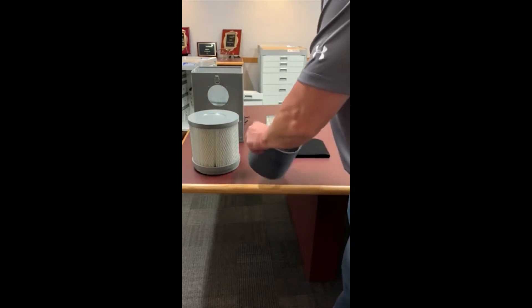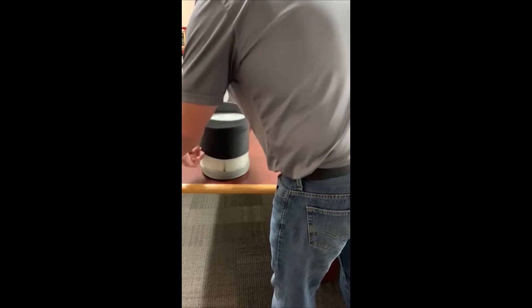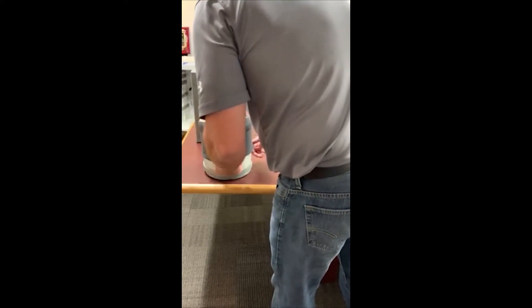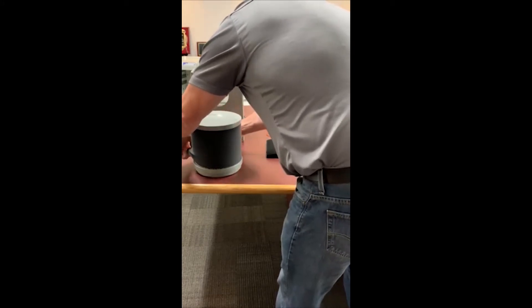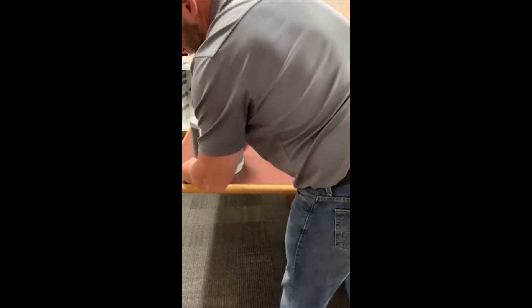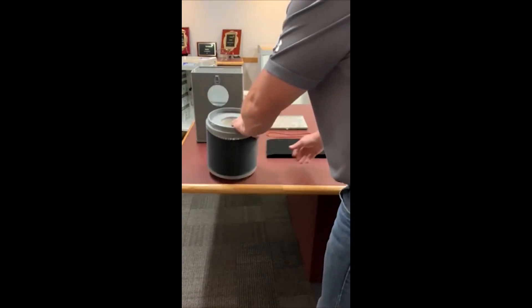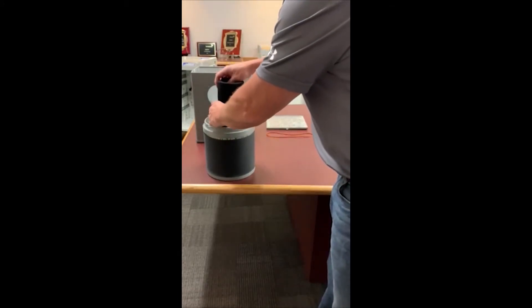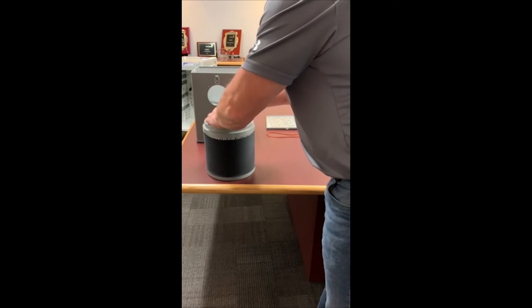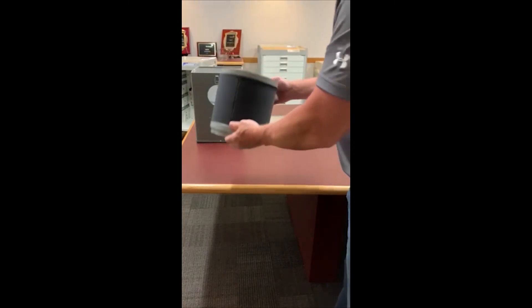First up, we're going to just slide the external filter over the main fan filter. Make sure it is pulled down around it completely, then flip it upside down. We're going to take the internal filter, literally just coil it up so that it fits in the opening in the bottom. That's your internal filter.